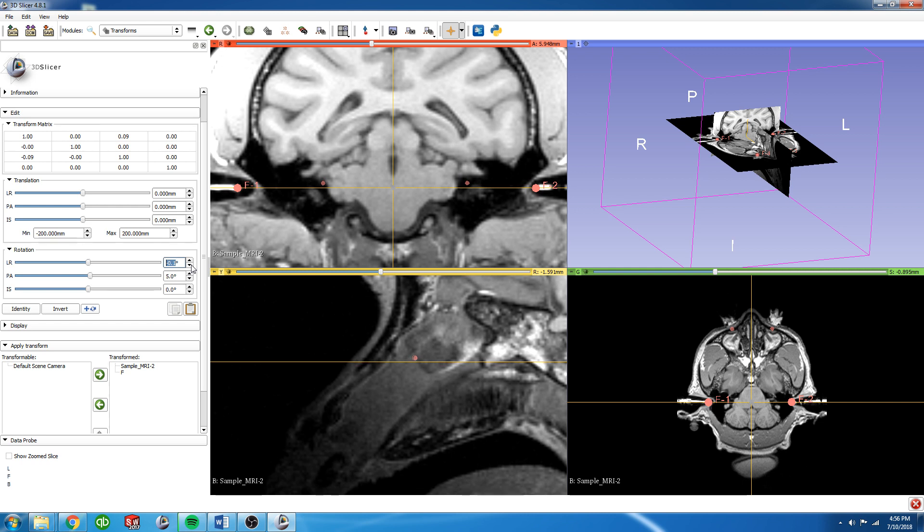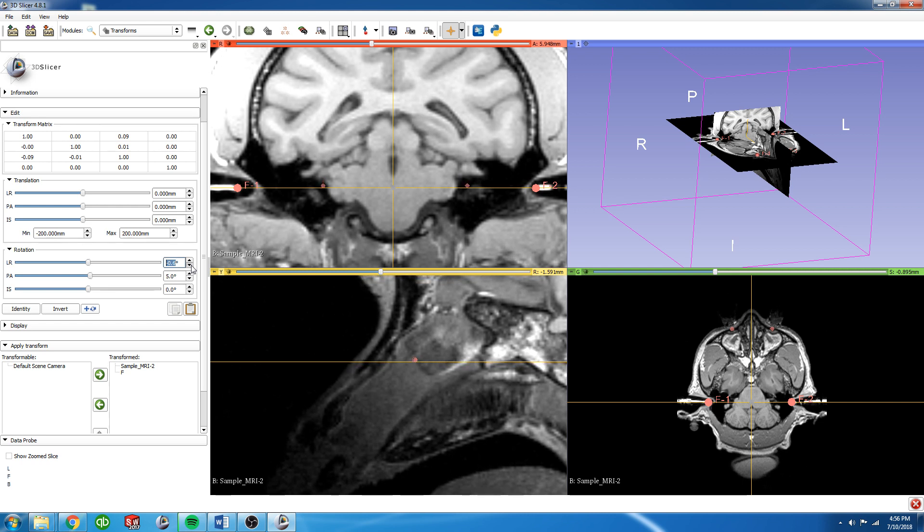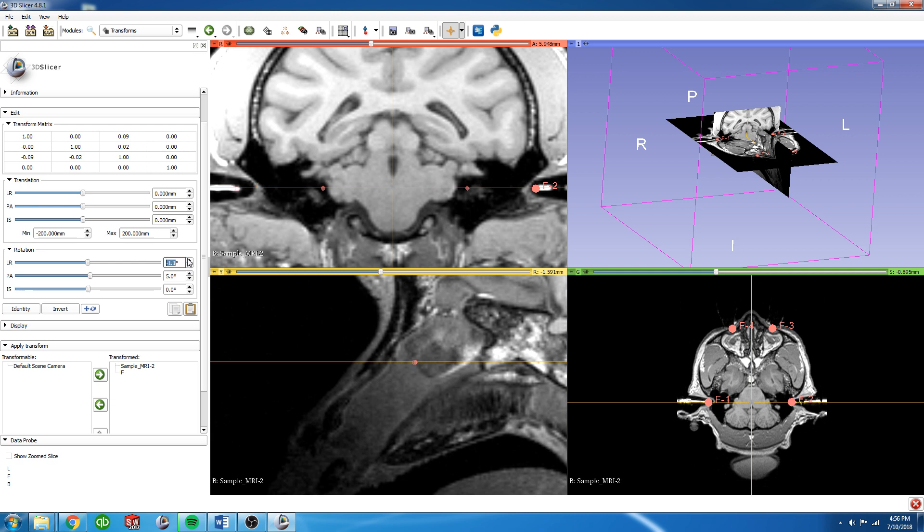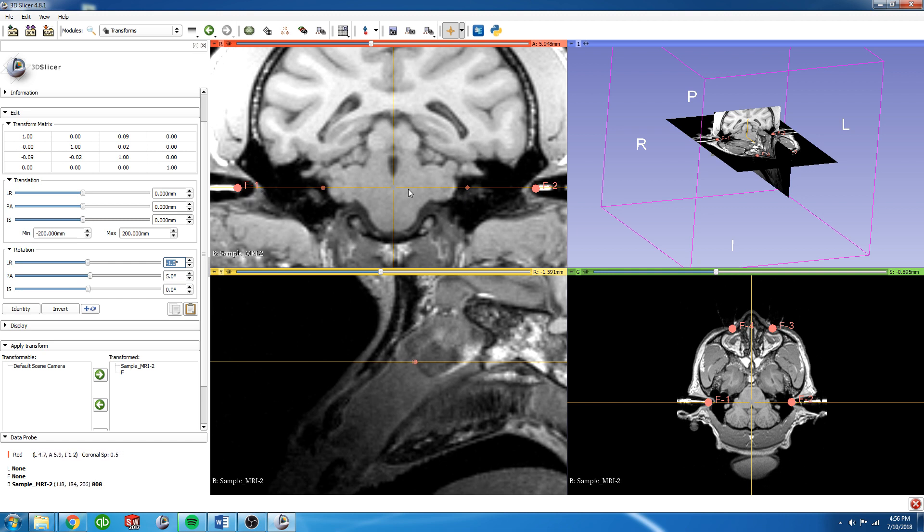I'm going to go ahead and start adjusting this a little bit. Looks like right there is pretty good. So you can see that now this line which is parallel to our plane is going through all four fiducials about right through the center.